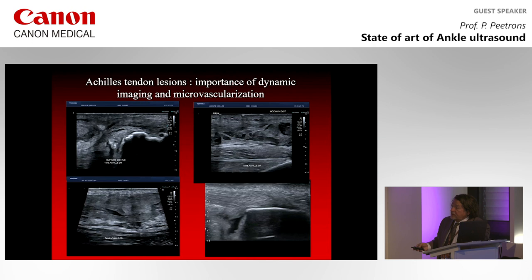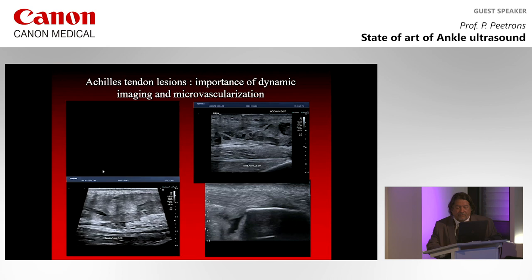Okay? Which tendon, or what are the tendons, which are completely destroyed? This one? This one? Or this one? This one doesn't look to have any abnormality. Look at the dynamic imaging of this one. No, that one, I mean.